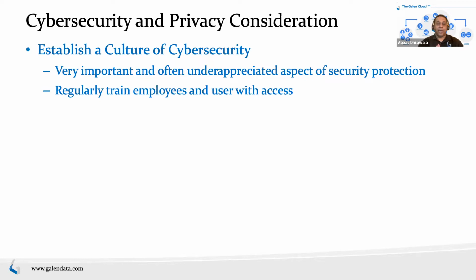A lot of cybersecurity, there's a question about, from a usability perspective, how do usability and cybersecurity go together? A lot of that is framing. Right. So as part of your framing or education or marketing to your patients or to your customers, you can ingrain that cybersecurity is needed.